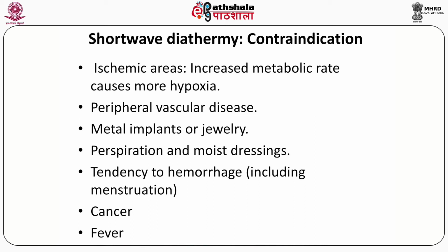Another contraindication is perspiration and moist dressings. If the patient is wearing some moist dressings, we should not use this shortwave diathermy, as it may cause short circuiting in the conducting circuit. Also, if the patient has any tendency to hemorrhage, like if he or she is suffering from any bleeding disorder, then this shortwave diathermy technique is best avoided.